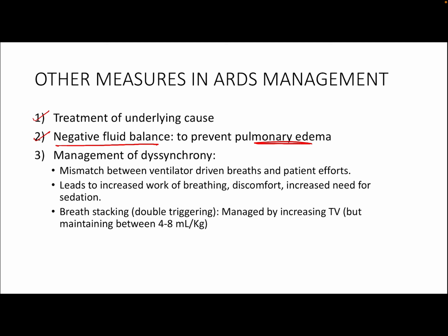The next important concept is management of dyssynchrony. A dyssynchrony means a mismatch between ventilator-driven breaths and patient's efforts. What this can lead to is it will increase the work of breathing for the patient, it increases discomfort, and it increases the need for sedating the patient, higher amounts of sedation, which is not really good.